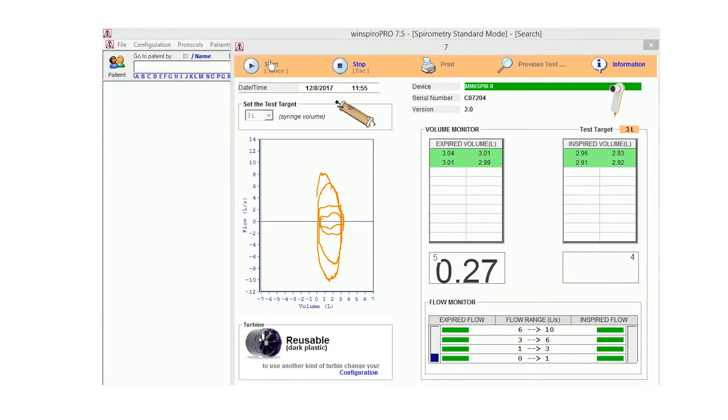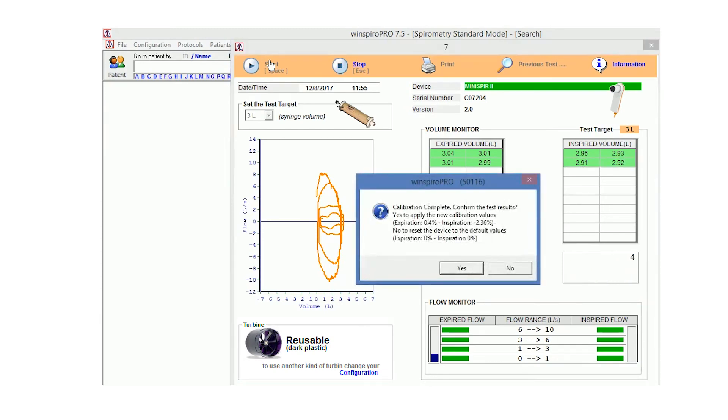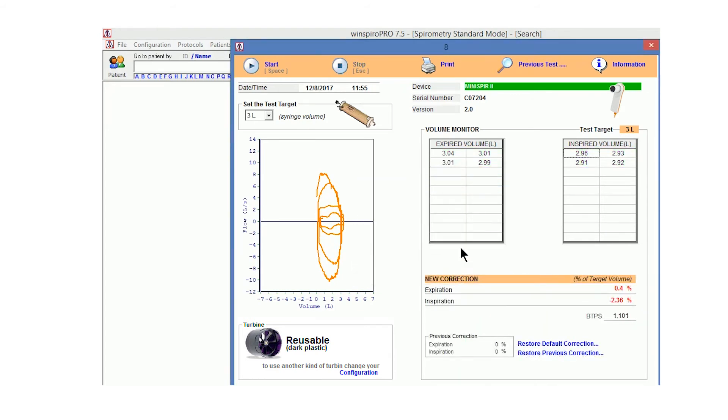When all bars are green, the test will stop automatically. We want the results under the new correction factor to be plus or minus three percent. If they are, then you have a successful calibration check and can print out the results and place them in your calibration file.